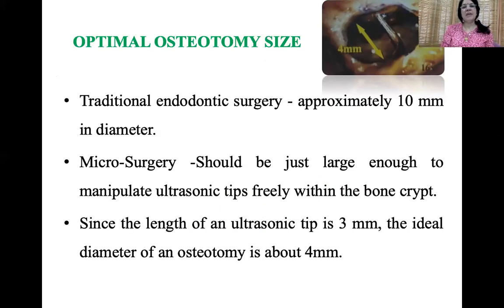The optimal size of an osteotomy is this big. It should be at least big enough to give you good access to the surgical site. If you are using an ultrasonic tip, as you do in a microsurgical procedure, then the length should be 4 mm.